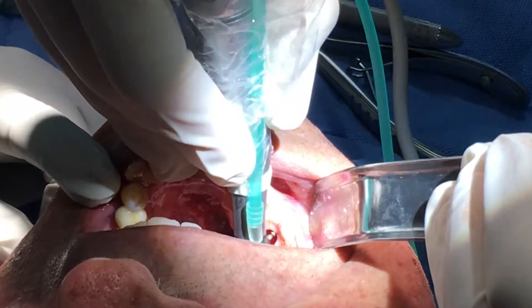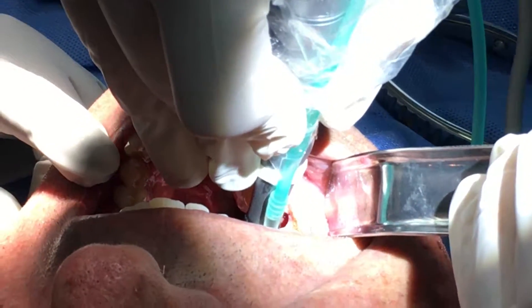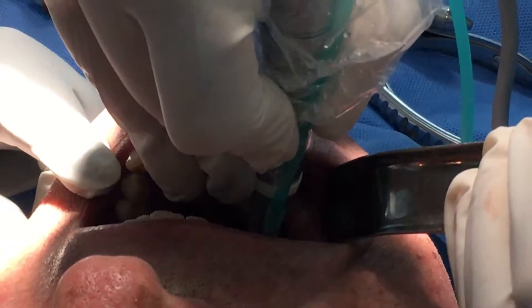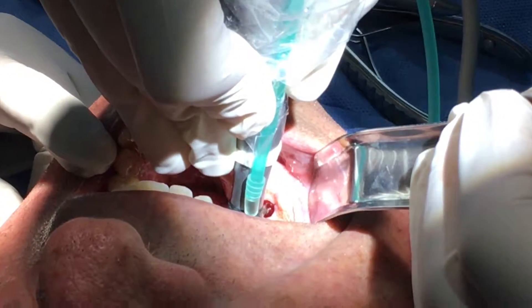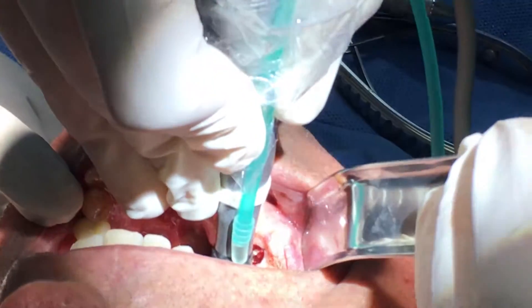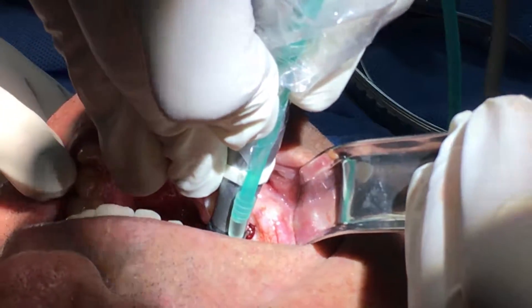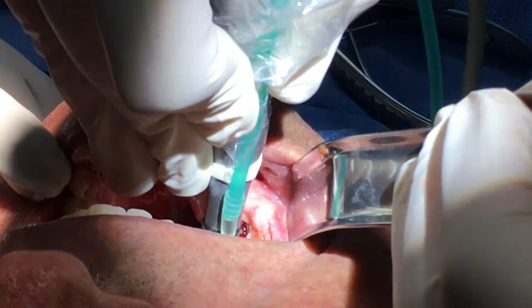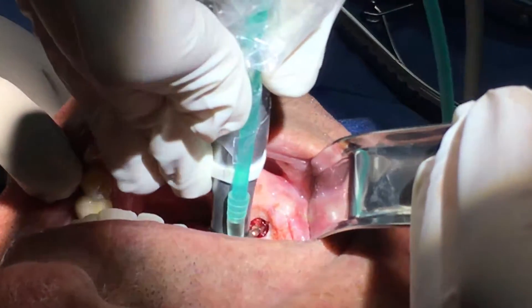Here I'm using a slow, non-irrigation technique. The nice thing about doing it at slow speed like this is that in cases where we need to do bone graft, we can actually harvest some of the autogenous, or natural, bone on the drill and be able to reuse it.